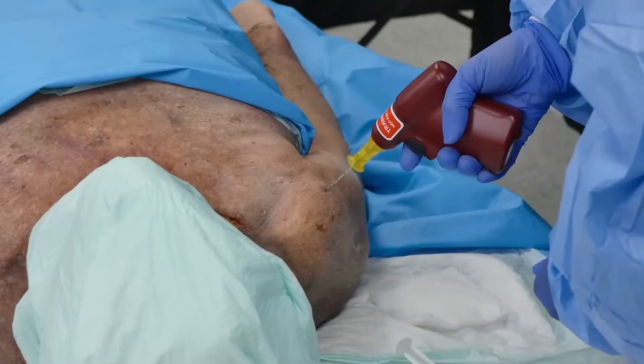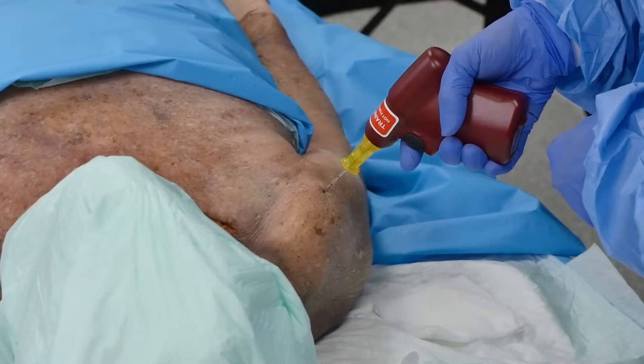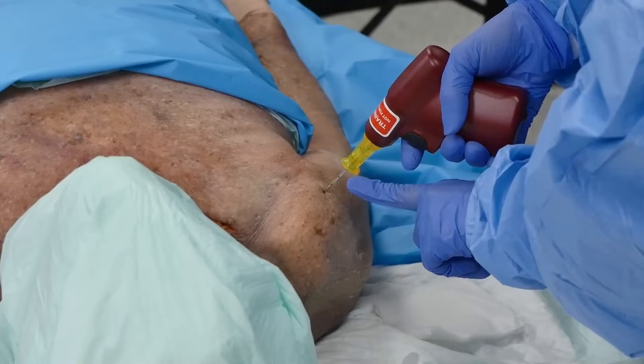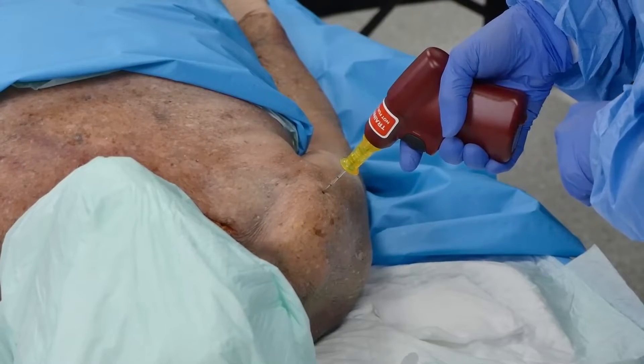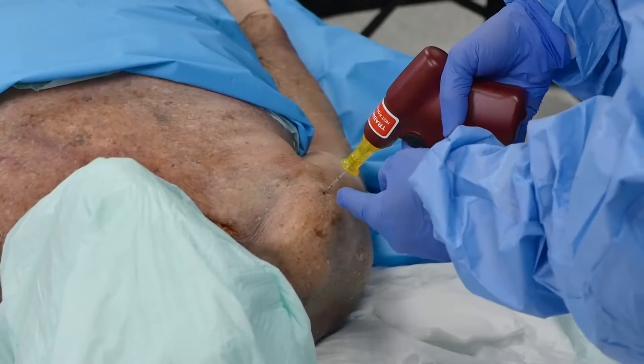I'm going to insert through skin and touch bone gently without engaging the driver by pulling the trigger, ensuring that I can see at least one black line above the skin before I engage the driver by pulling the trigger — and I can.